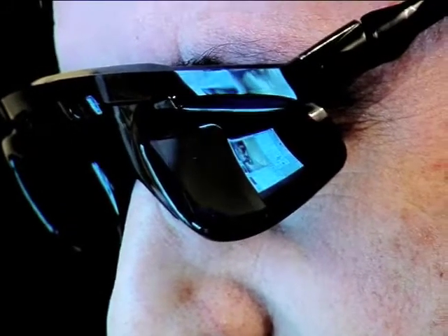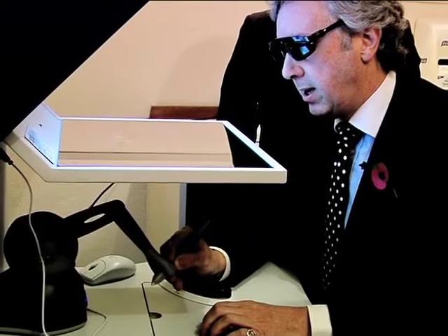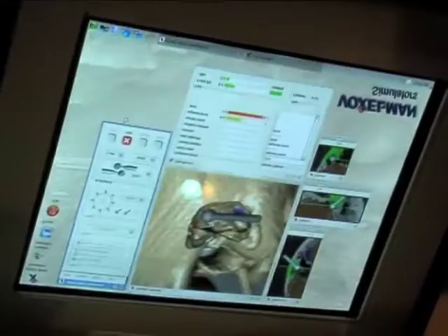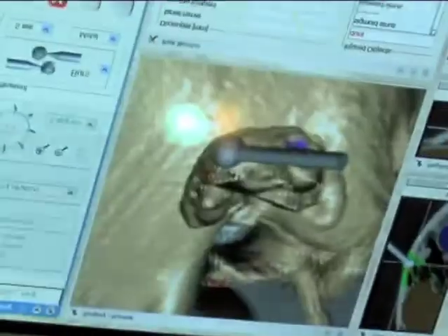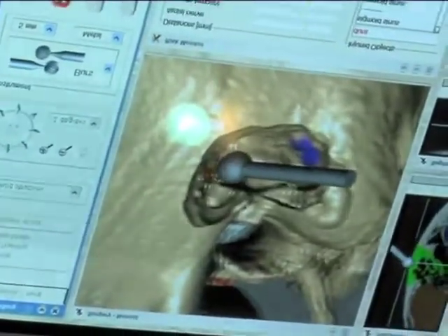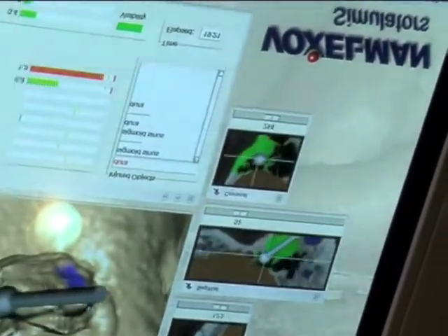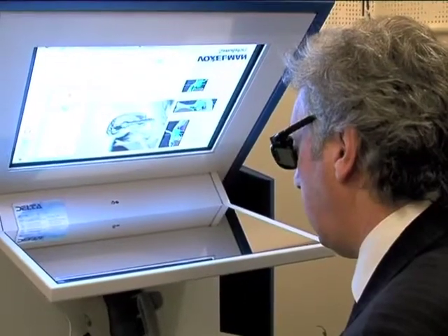This is a computer which has loaded into it a mastoid bone surgery simulator. The idea is to give realistic training for juniors. We have a wand which is effectively a drill bit, and within here we've got the temporal bone mocked up. We can practice drilling on it, and as well as seeing what we're doing, we've got a CT scan alongside which shows us where the drill bit is and how far we are from the various important structures.